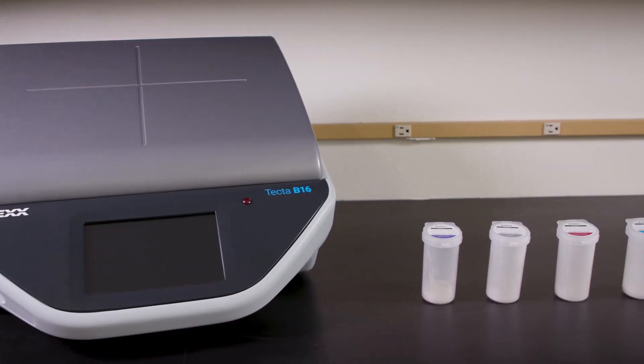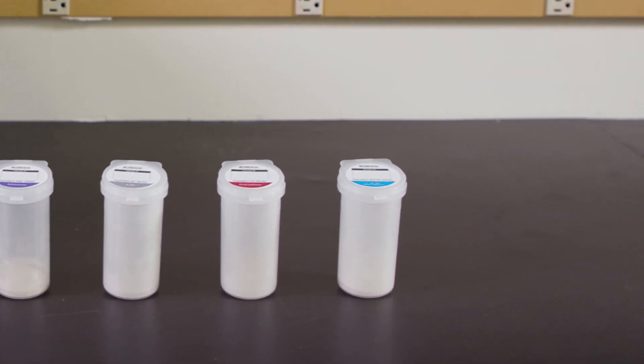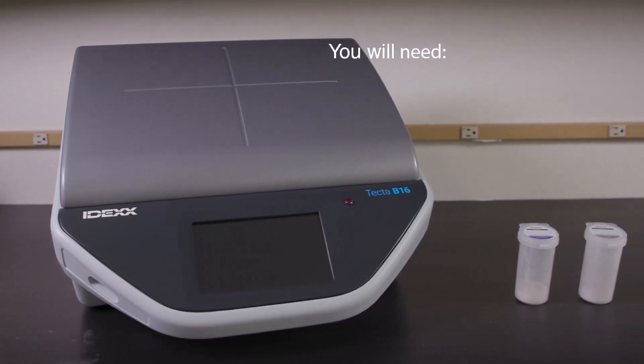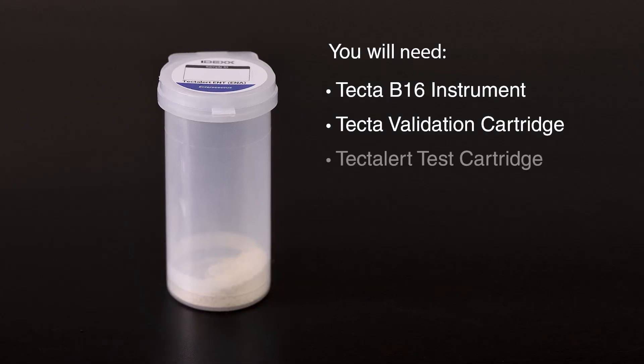In the next few minutes, you'll learn how to process a sample using the TECTA B16. In this video, we will use the TECTAlert ECTC test for the detection of total coliforms and E. coli. To process a water sample, you will need a TECTA B16 instrument, a TECTA validation cartridge, and a TECTA alert test cartridge.